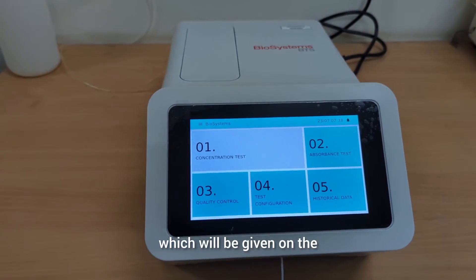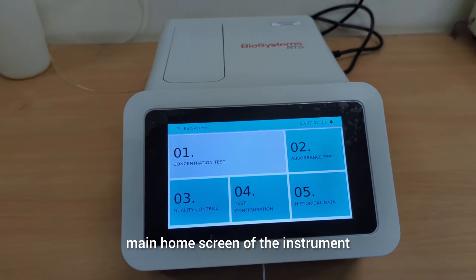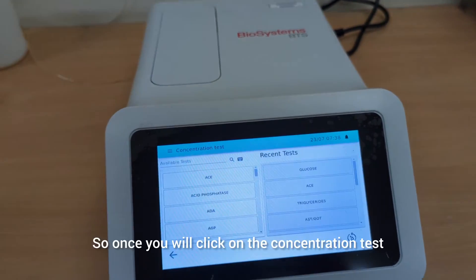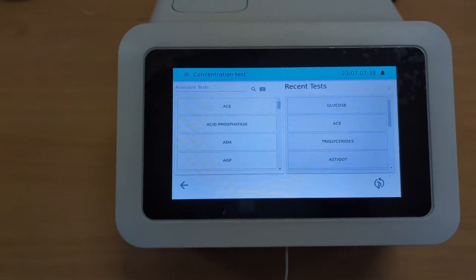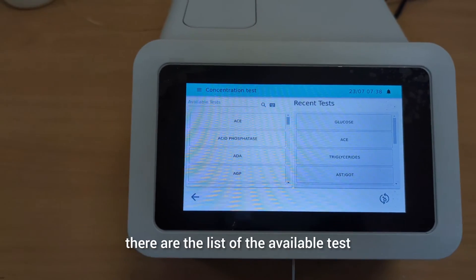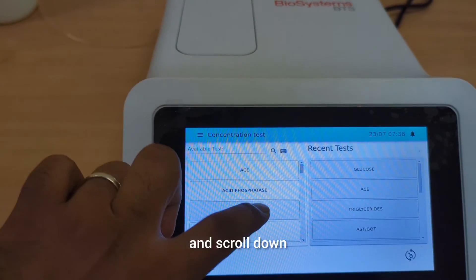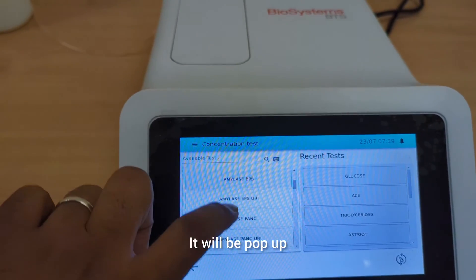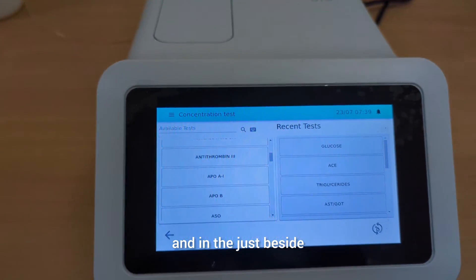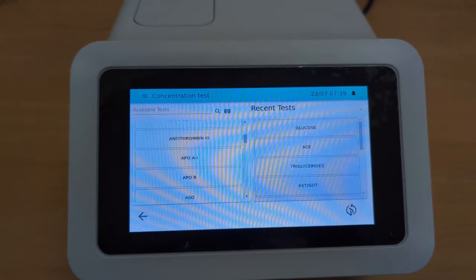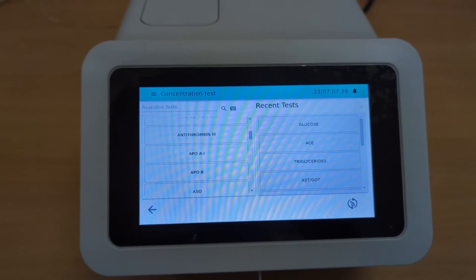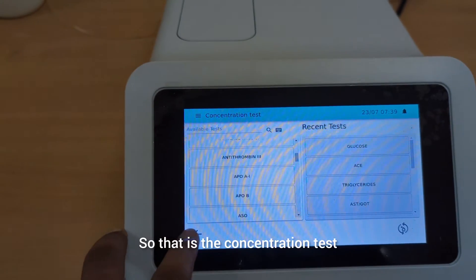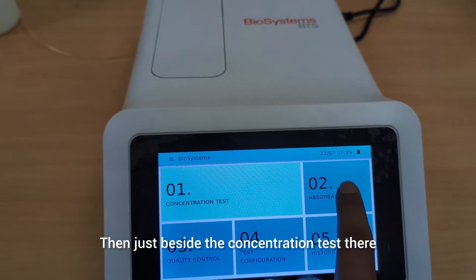These are the sections on the main home screen of the instrument. First, there is a concentration test. Once you click on the concentration test, there is a list of available tests. When you scroll down, different test lists will pop up. Just beside that, there are the recent tests, like glucose and triglyceride, which have been done recently. That is the concentration test.